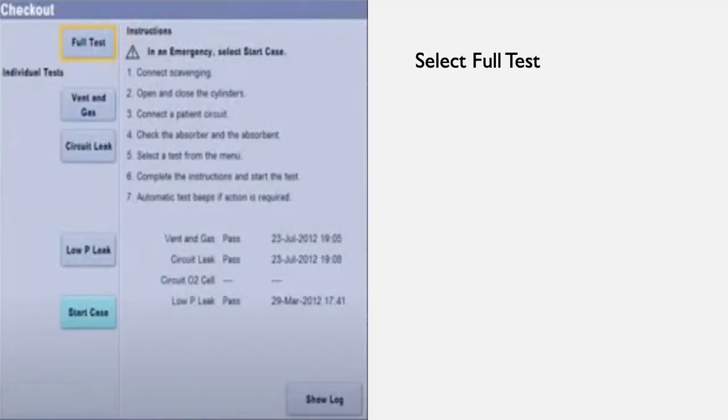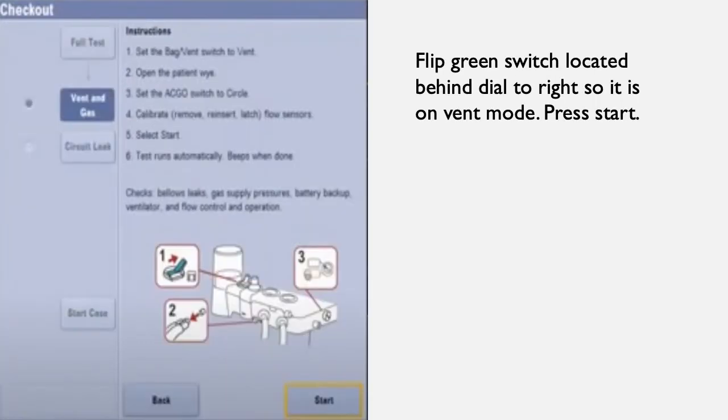Once the ventilator is turned on, the screen shown will pop up. You will then select full test. Make sure the green switch is on vent mode and press start.